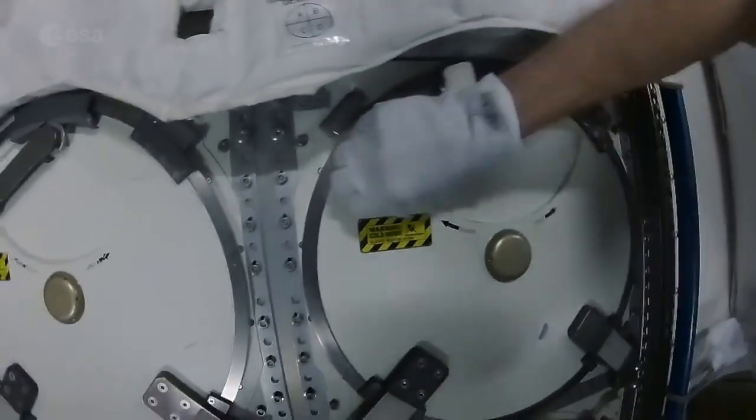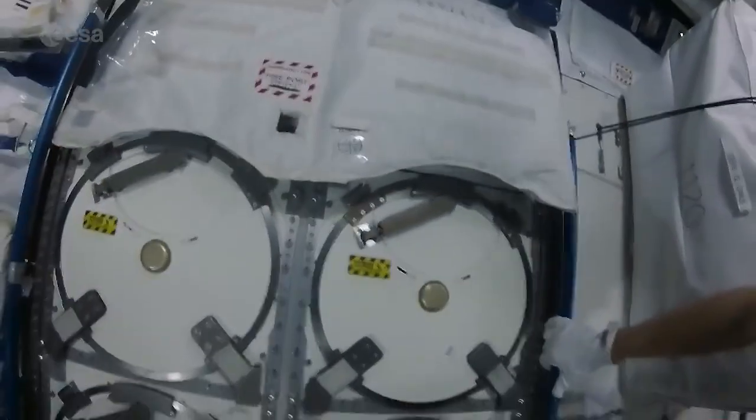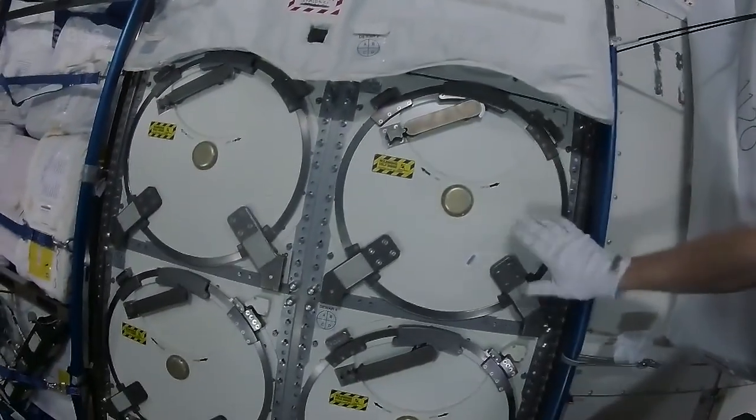And that's all done. Those blood tubes will then return on a SpaceX vehicle at some point in the future.